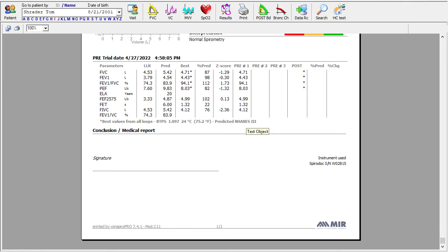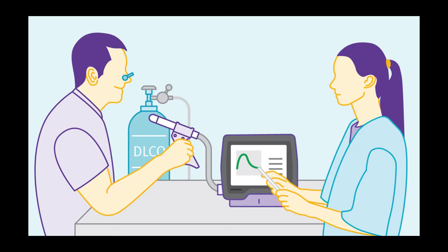Now, the results may sound like the participant is below the expectations for someone of his body type. However, when assessing the FEV-1/FVC ratio, the participant was predicted to have a percentage of 83.9, and he scored a percentage of 94.1. You're probably wondering what that means. No worries, we forgot to let you know in the beginning.